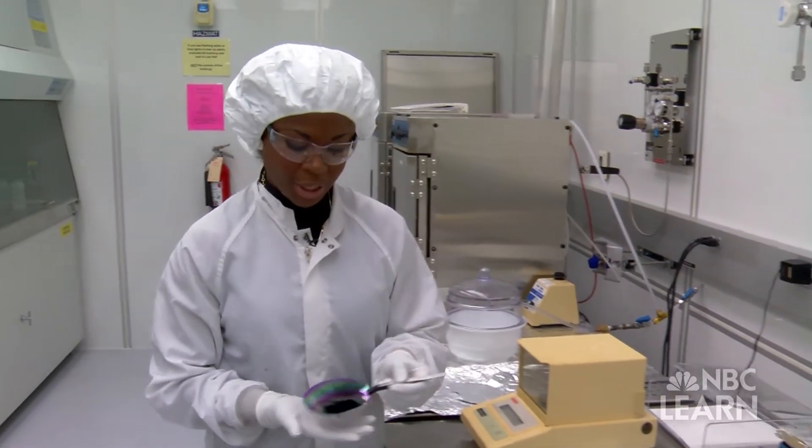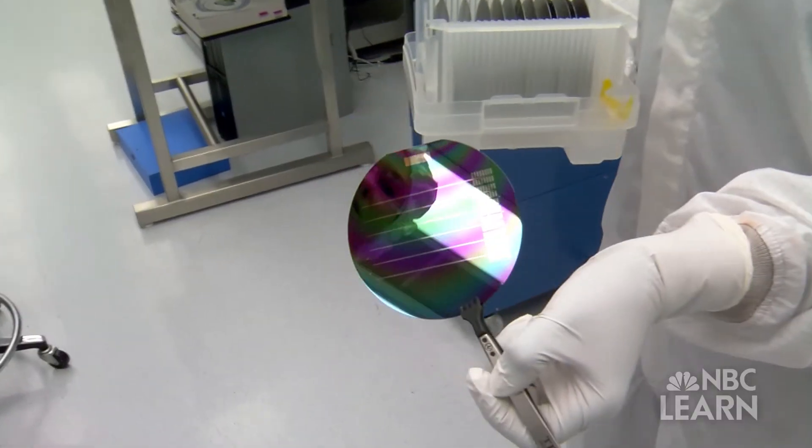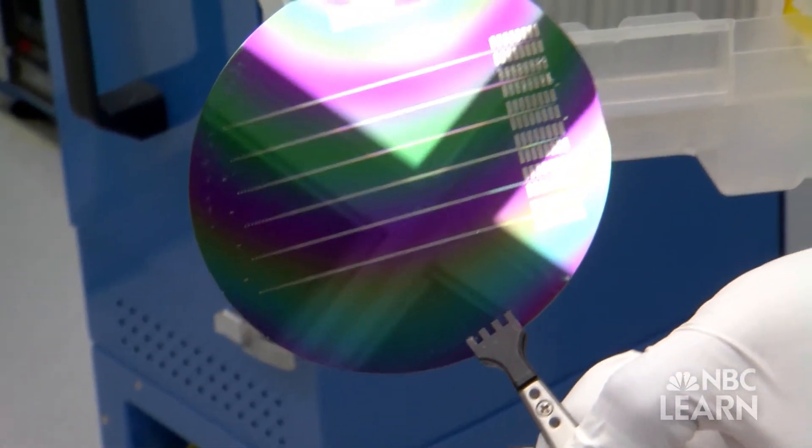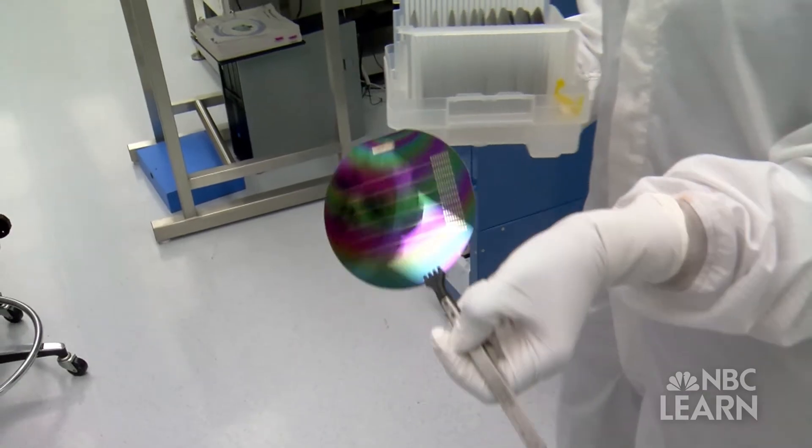This is one wafer that has, so you can see the little dots on it are the electrodes, and these are the bond pads back here. So this is one type of design.